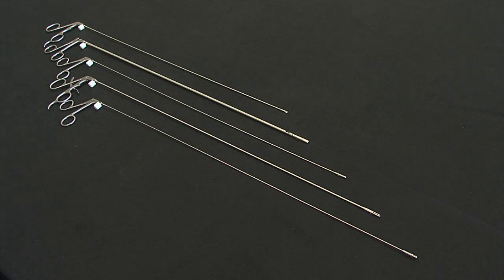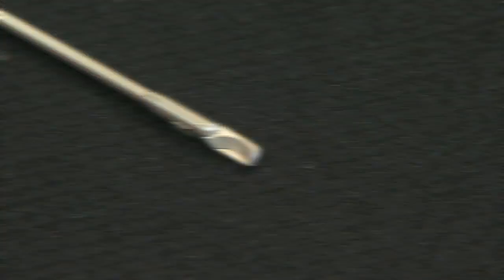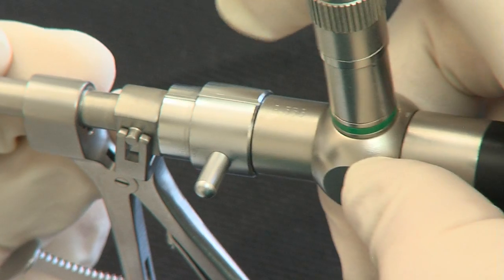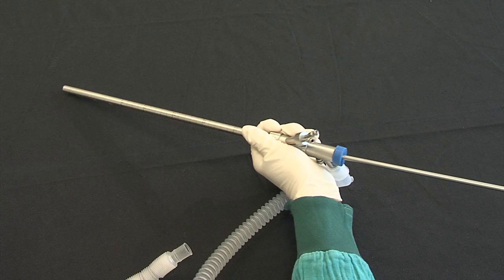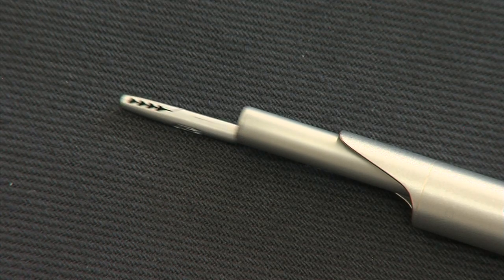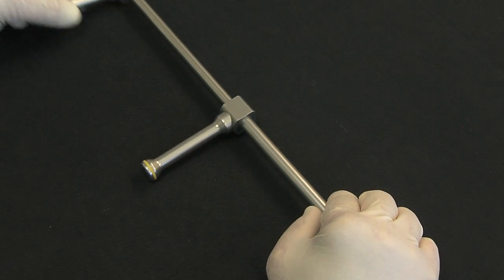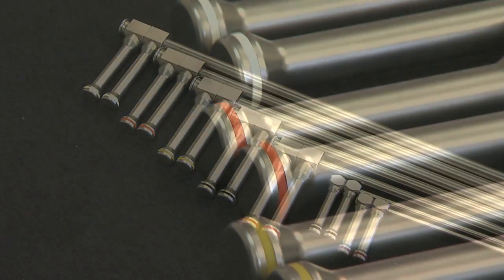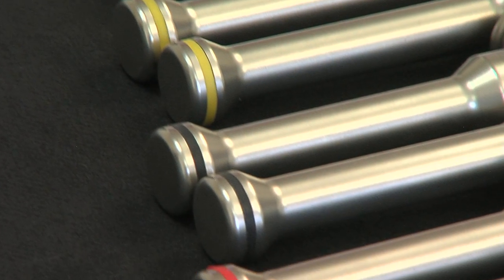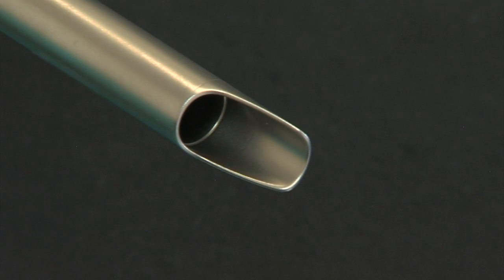Various instruments can be inserted through the bronchoscope, such as forceps used for biopsies, foreign body retrieval, or scissors. Optical forceps are also available. The bronchoscope is round and completely smooth, allowing easy insertion of a large diameter stent introducer. Each main tracheobronchial tube has its corresponding stent introducer, quickly identified by the same color coding. To avoid harming the bronchial tree, the stent introducer cannot protrude out of its corresponding tube's distal tip.